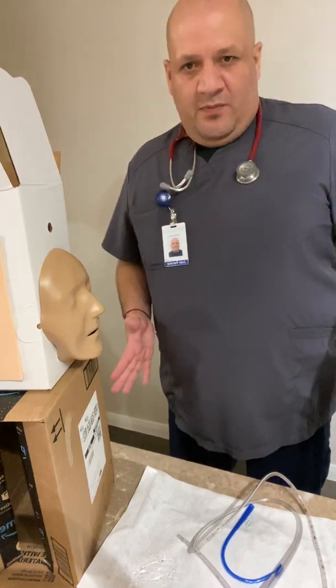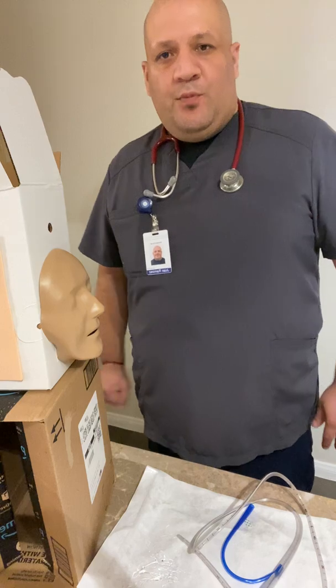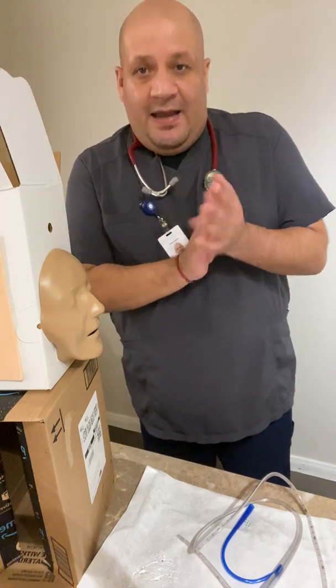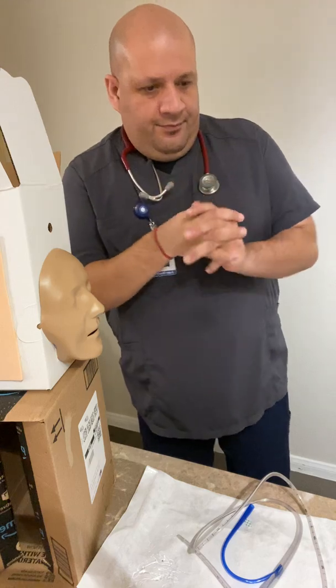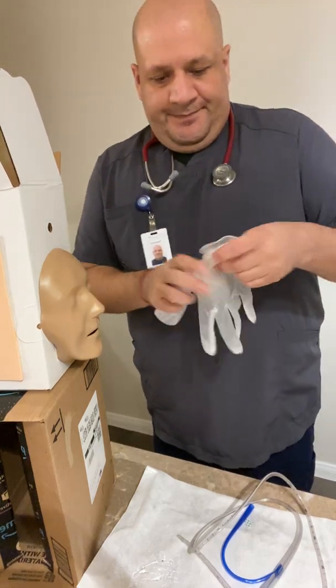So now that I have my supplies ready, I'm going to go ahead and do the process for the NG tube. I'm going to go ahead and perform hand hygiene. Okay. I'm going to go ahead and put some gloves on.